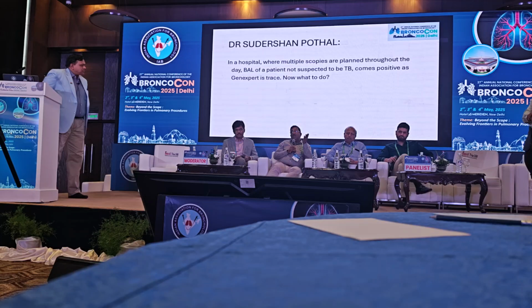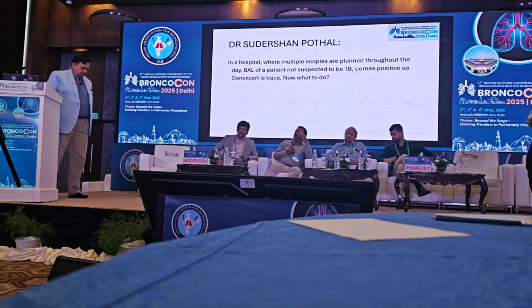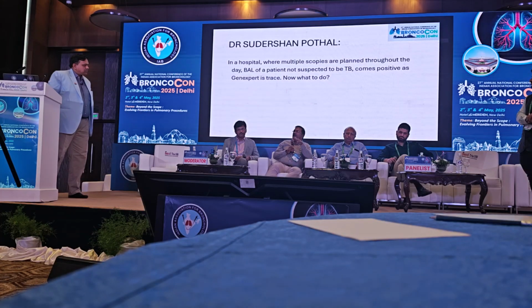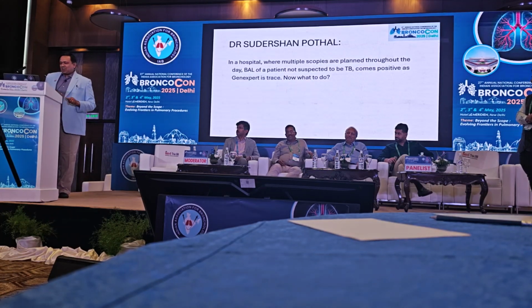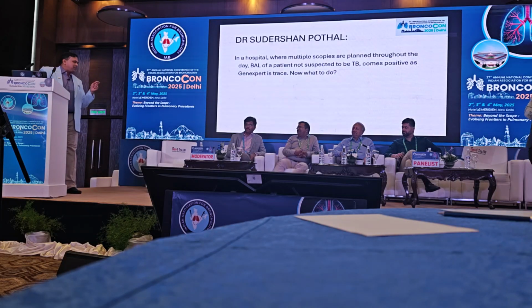But from the other perspective, suppose the bronchoscope is exposed to the tuberculosis bacillus. It could be that the first patient's bacilli contaminated it, so we need to check whether our classical protocol of sterilization is covered. Third, suppose multiple scopes are available, I think we can dedicate one scope for tuberculosis. Yeah, if you have that option available in your institute, definitely. And one more thing, you can just give a call to the previous person who did the scopy: was your patient positive? Just to get an idea that if that one was positive and yours also comes positive, it might be that disinfection was not done properly.